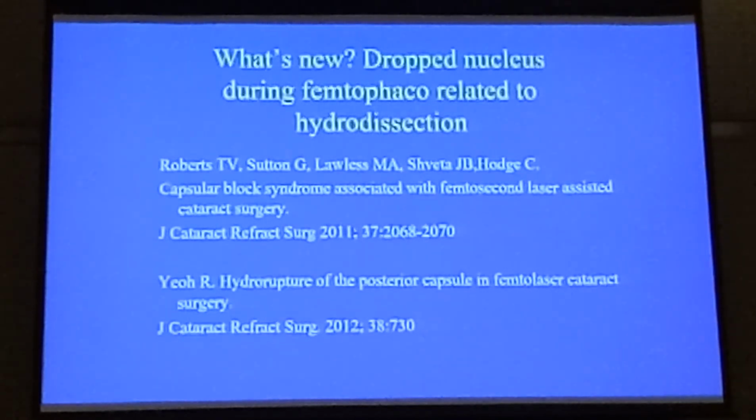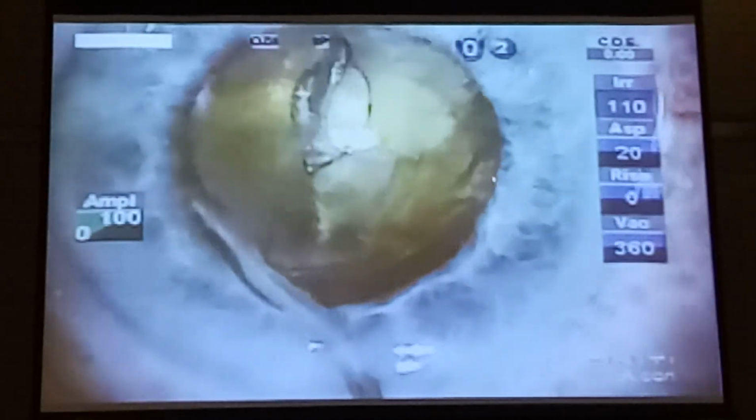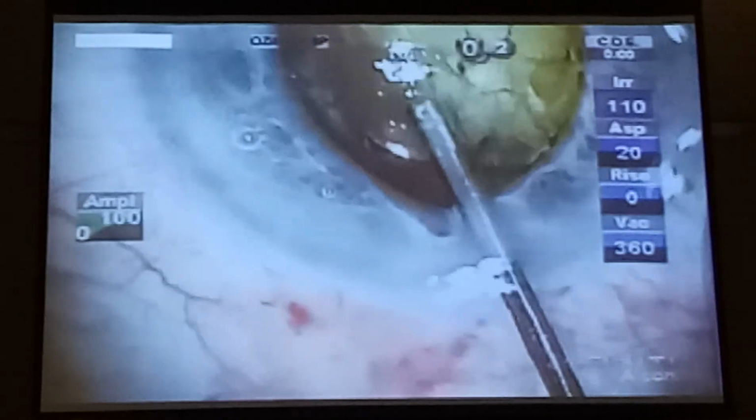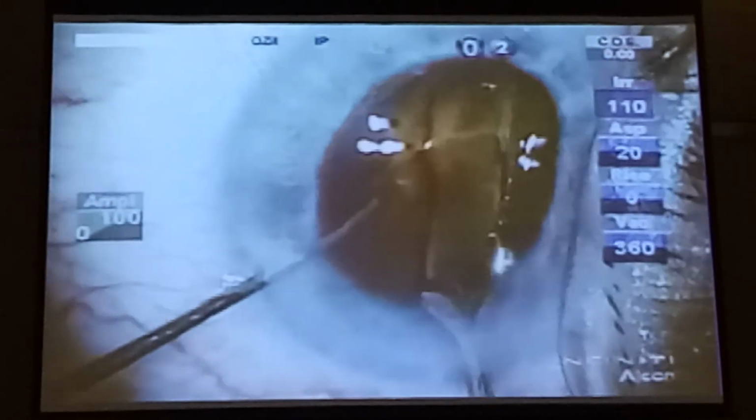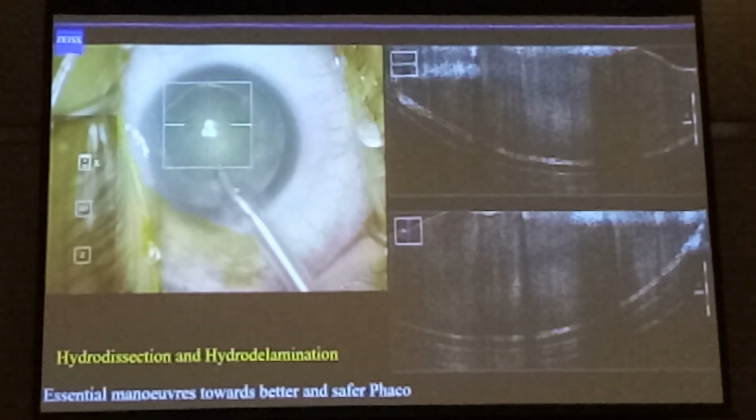Okay? So another place where it's relevant, when femtosecond laser cataract surgery first came into being, Tim Roberts and his group reported 2 or 3 cases in one list where they had dropped nuclei. And here's one of his videos. Now just watch after the femto, he's doing his hydrodissection. Watch that, people. There's a gentle snap sign there. Now what happens in femto? They get gas formation in the capsular bag. It means that the capsular bag volume is increased, greater intralenticular volume, and then if you hydrodissect with the same force, you're going to rupture that posterior capsule and get the snap sign. So although this sign was described 20 years ago, it's still got relevance with lens touch cataracts and post-femto cases.